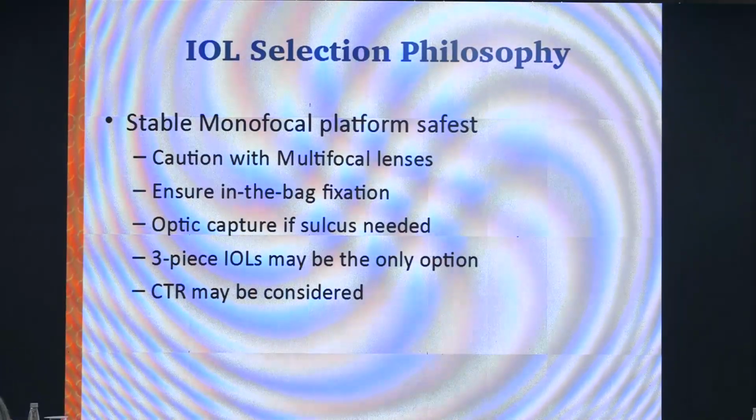Obviously, the IOL of choice in such high myopes is a multi-piece lens because it fits into the bag very well, but you can have other options as you desire. The multi-piece lens has another feature, it has a very sharp optic edge, and that prevents PCO formation. And we all know that YAG in such cases may contribute to a retinal detachment.